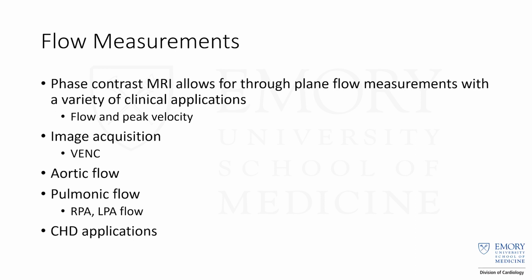So you can get the flow through whatever section and whatever slice that you're getting, and I'll show you how to do that. And basically that gives you the exact milliliter flow through that section. It also will give you the peak velocity through that slice as well.